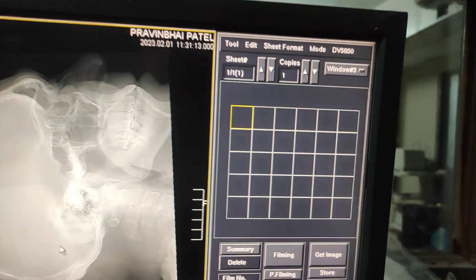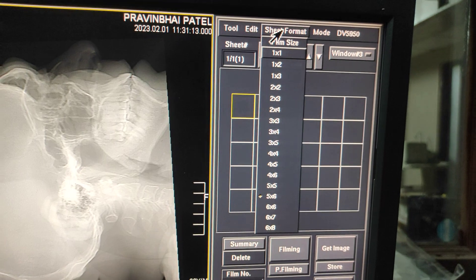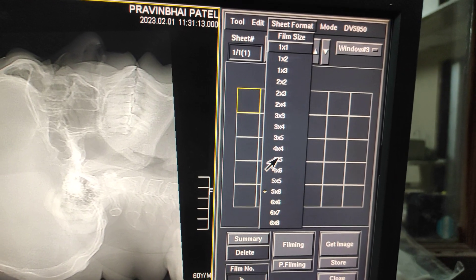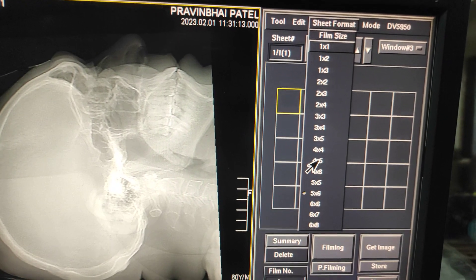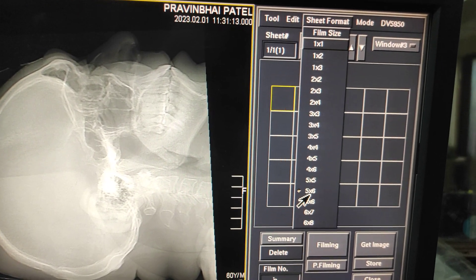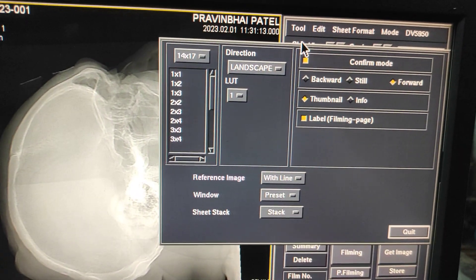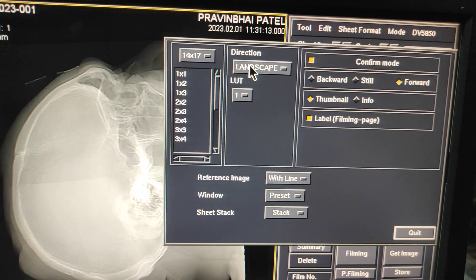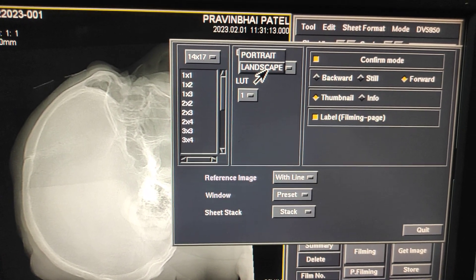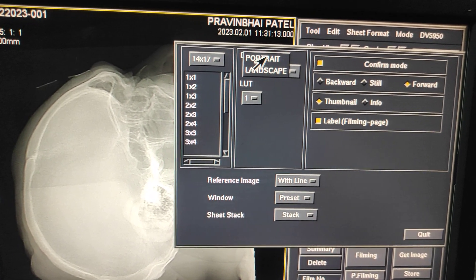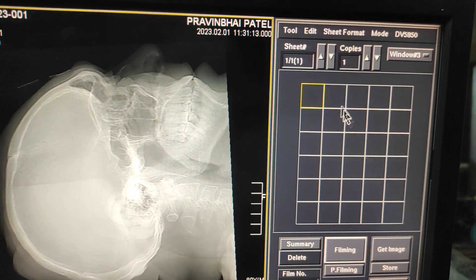Now, from here you have to select the sheet format — whichever sheet you want. I am using 4 by 5, which gives 20 images, and 5 by 6 gives 30 images. From the tool option you can change the direction of the film — whether you want landscape or portrait. Here I am selecting portrait.